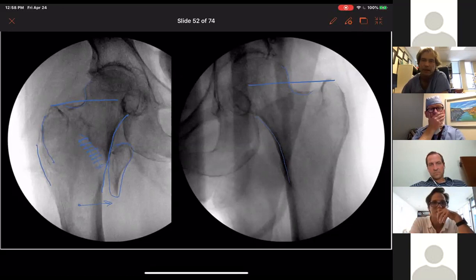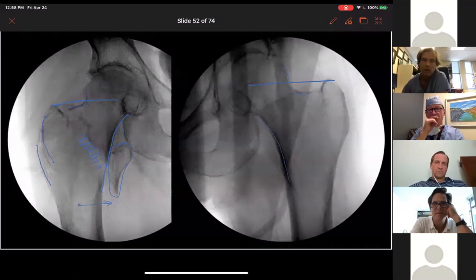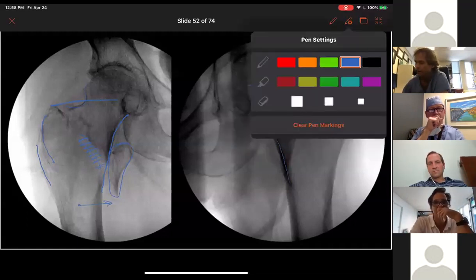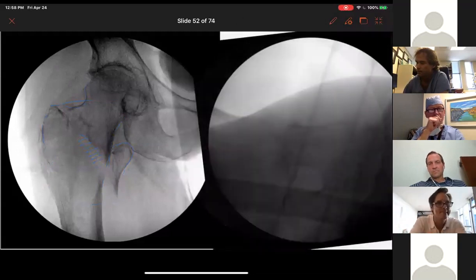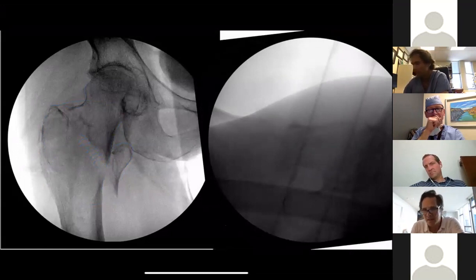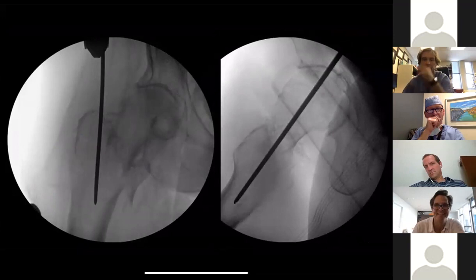So this is when you guys are thinking something lateral on the shaft to medially translate it. Is that fair? Or something over the top to grab the medial neck and pull it laterally, but the same basic concept. Yeah, one or the other. Okay. All right. So here's our lateral. Sucks, right? Can't see squat. So we're going to redo it. And there's our lateral. See it a lot better.